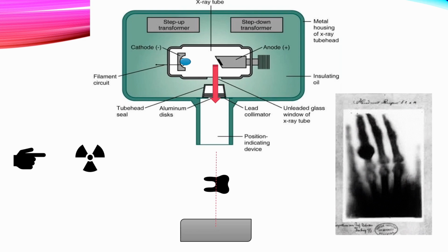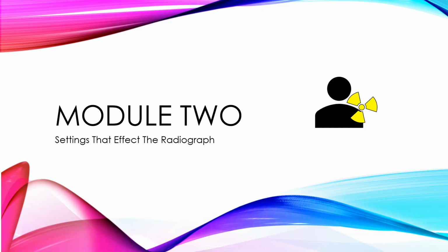We are creating a shadowgraph, but instead of using the light radiation or the visible light that is lower on the electromagnetic spectrum, that doesn't have enough penetrating power to get through your skin, we are using a little bit higher penetrating power, the X-rays, that have enough penetrating power to get through tooth and tissue, that can pass through the soft and hard surfaces to project this image not on the wall but on the film or the sensor. It's interesting that dentistry is ever evolving and changing, but the original science dates back to 100 years ago. Actually more than 120 years ago.